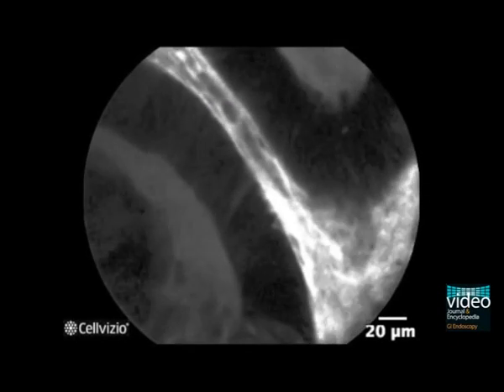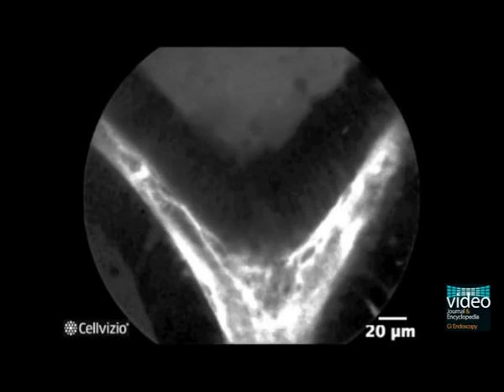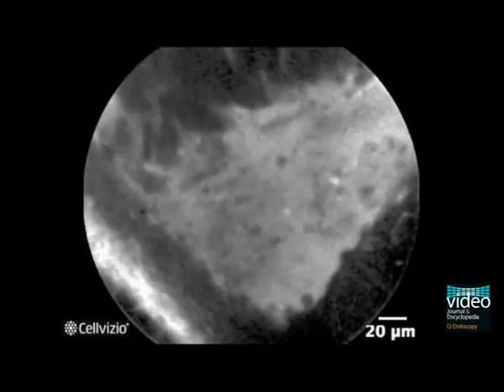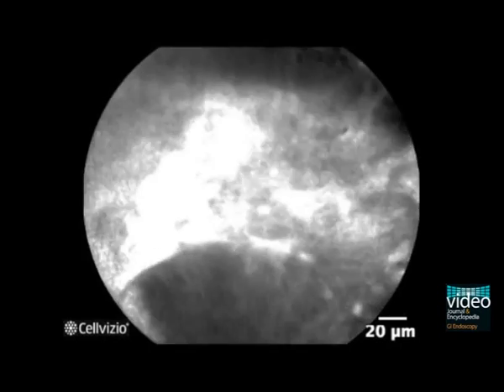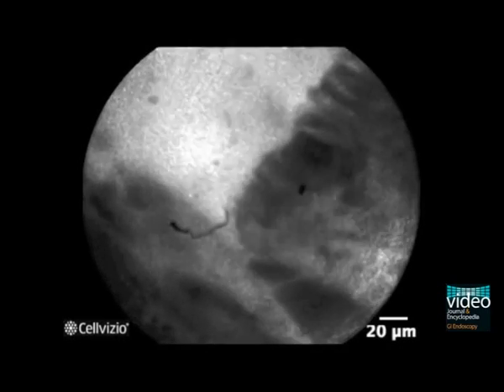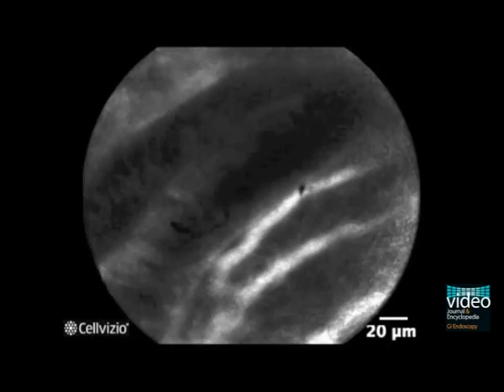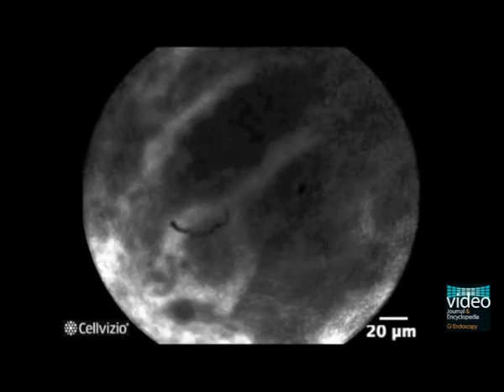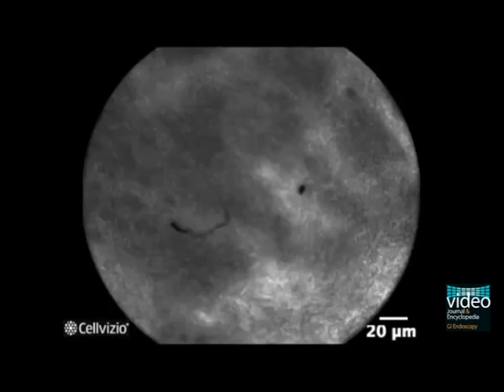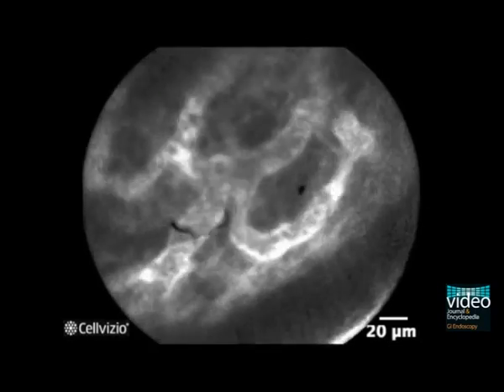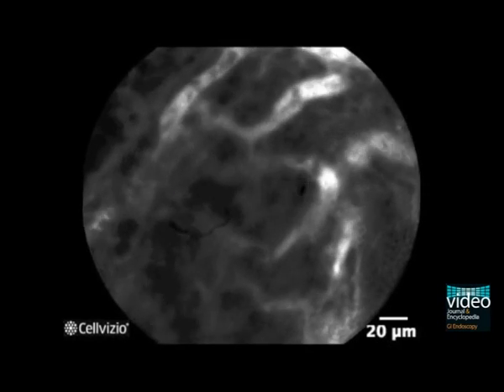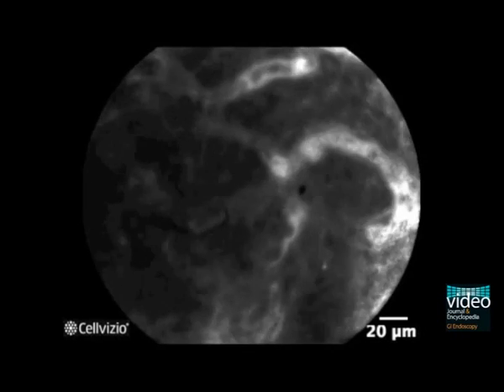Probe-based confocal laser endomicroscopy imaging of the polypoid mass is highly suggestive for dysplasia, showing an irregular architectural pattern characterized by irregularly sized and disrupted crypts, tubular-shaped crypts with goblet cell density attenuation and dark epithelial borders with villiform structures. The blood vessels are dilated and irregularly branching with poor orientation to adjacent tissue and fluorescein extravasation.